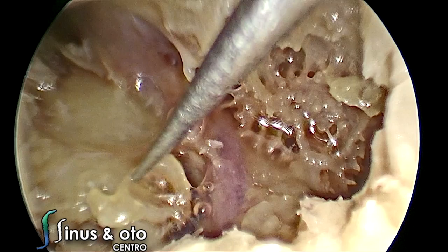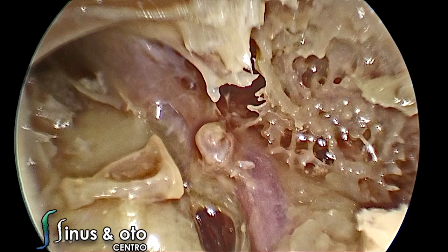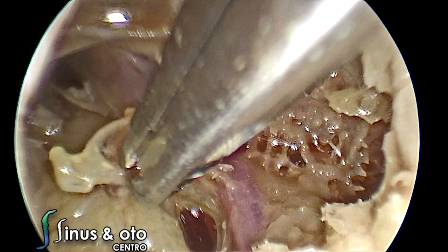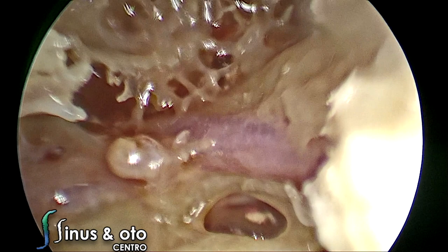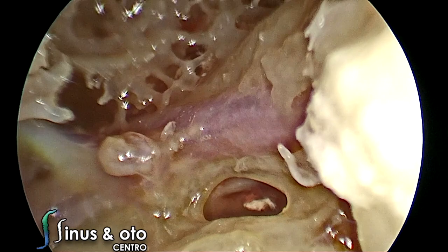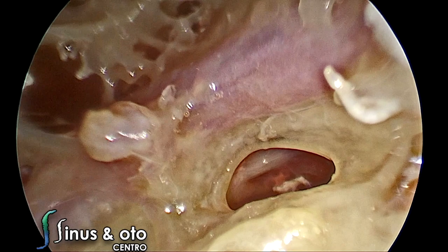Since the objective is to go to the inner ear, we are going to remove the stapes and open the vestibule. We are opening the vestibule from the middle ear side — this is a trans-canal approach. In the microscopic dissection, the vestibule will be opened via the mastoid region through a transmastoid approach. We remove the stapes and expose the vestibule.